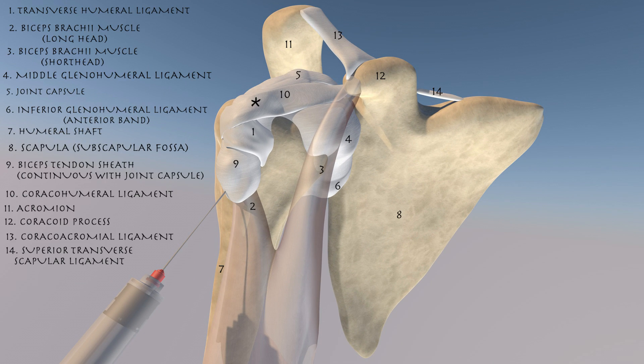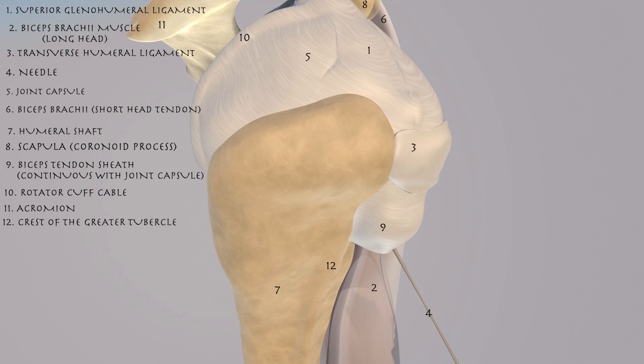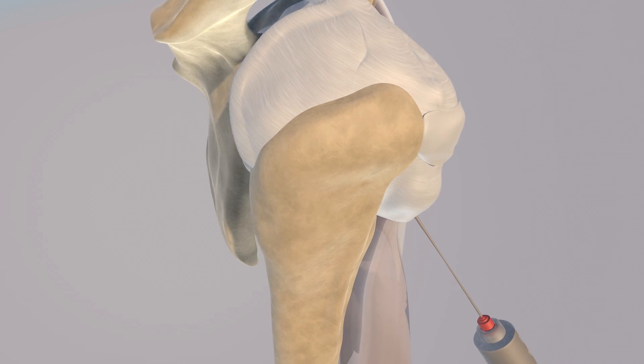You can appreciate the coracohumeral ligament, as well as the superior transverse scapular ligament. Here we're looking at the shoulder capsule from a superior perspective. You can appreciate the superior glenohumeral ligament, as well as the rotator cuff cable, which is a thickening of the capsule that goes from the greater to the lesser tuberosity, and essentially helps buttress and support the capsule and the rotator cuff.